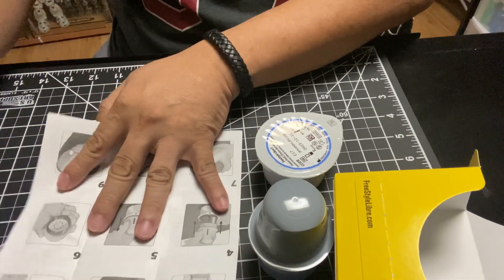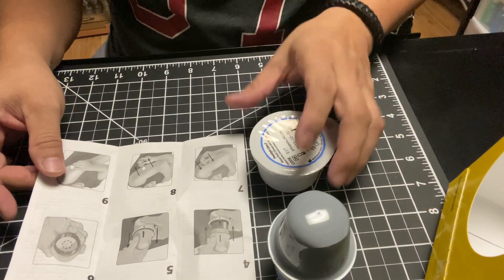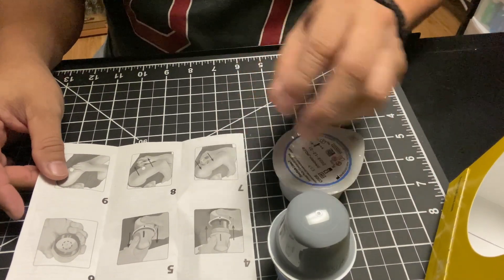The kit includes a picture instruction. You can also scan the QR code and download the app for instructions on how to apply the sensor.